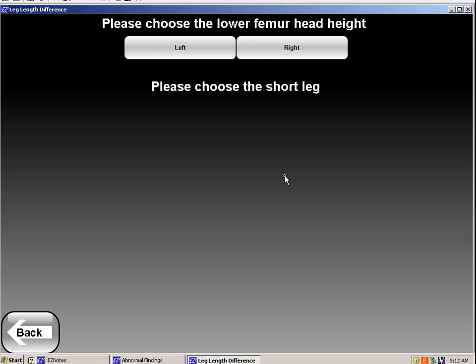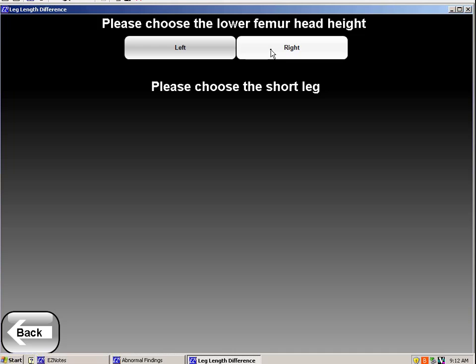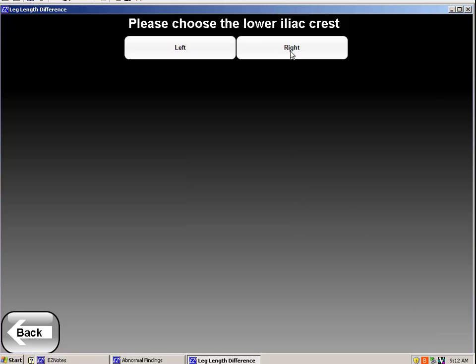I might see that the femoral head on the right was short by 9 millimeters and say done. And that the iliac crest on the same side was also 9 millimeters short. So I may be suspecting a short right leg.